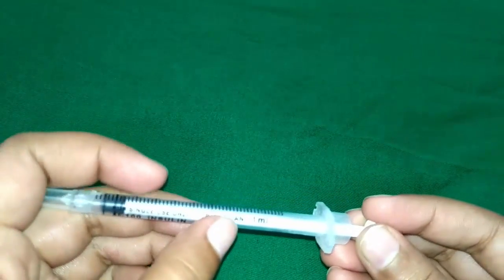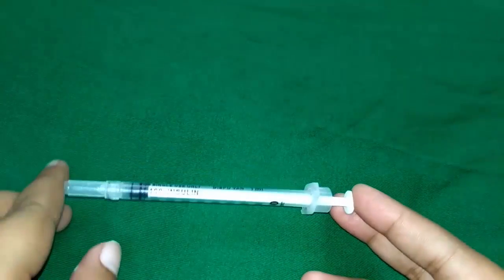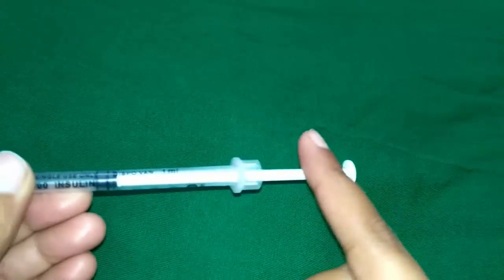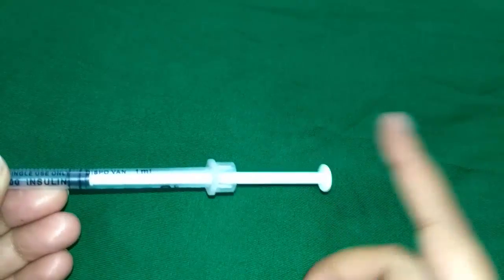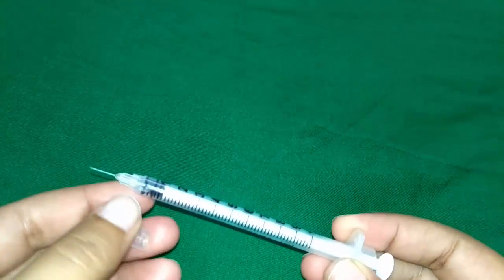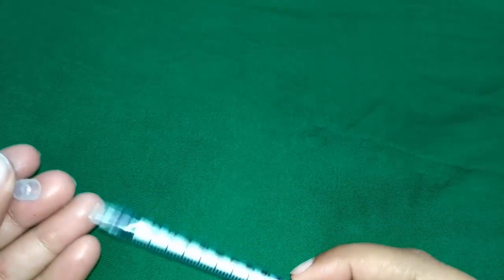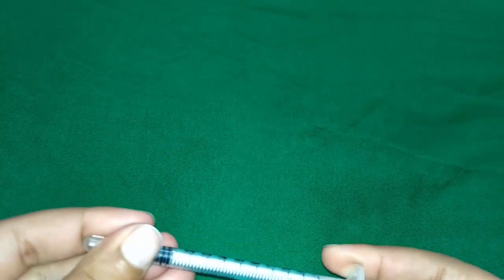This syringe is available in 1 ml and 2 ml sizes. As you can see here, this is a 1 ml. It is made up of plastic or glass with a white or red piston — here it is a white piston. It is available with or without a 26-number needle attached; here it is already attached. It is disposable, sterile, and ready to use.